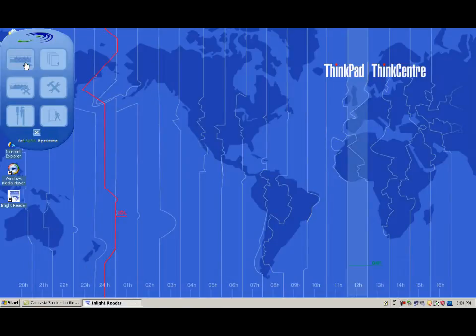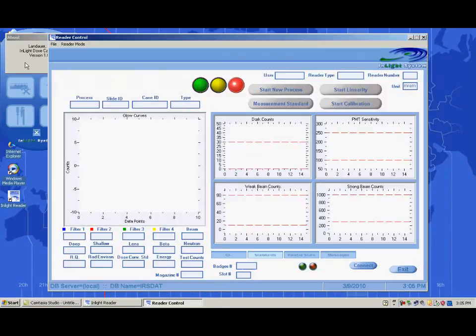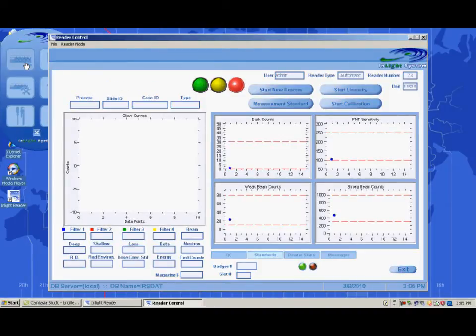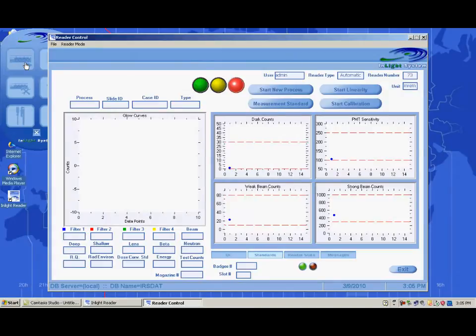Click the Reader button to start the Reader Controller application. Once the application is loaded, it will automatically initiate the standard measurement tests on the reader. Once the tests have been completed, the standards graphs will display dots indicating the results of the tests. If any test results are outside of the preset error or warning limits, a message will appear warning the user of the condition.